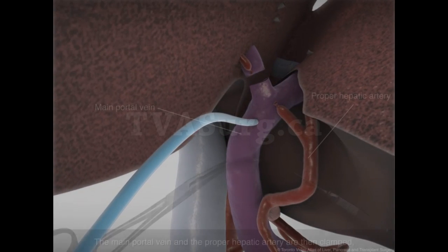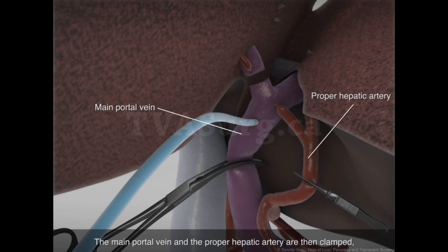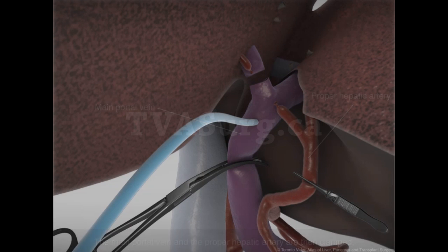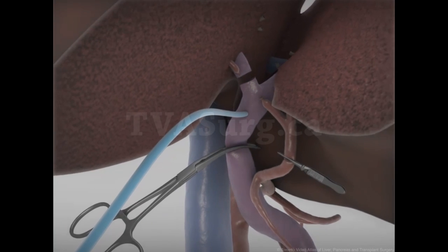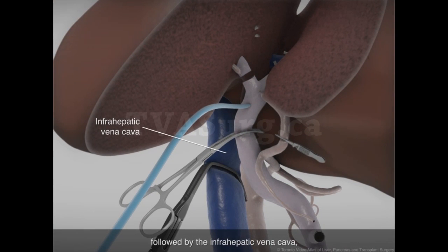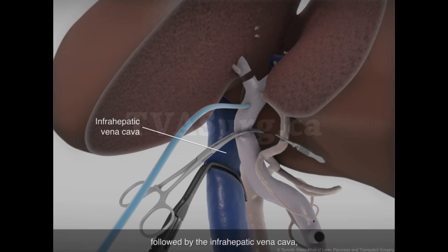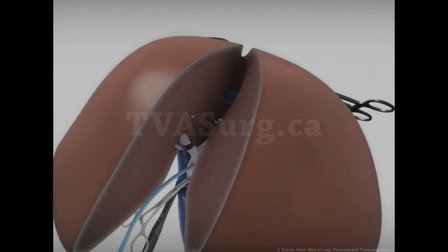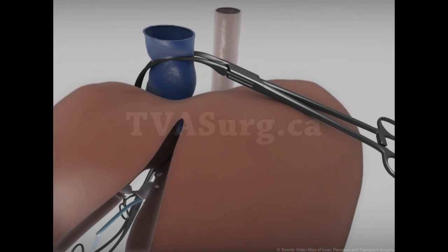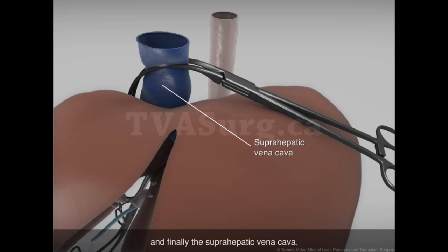The main portal vein and the proper hepatic artery are then clamped, followed by the infrahepatic vena cava, and finally the suprahepatic vena cava.